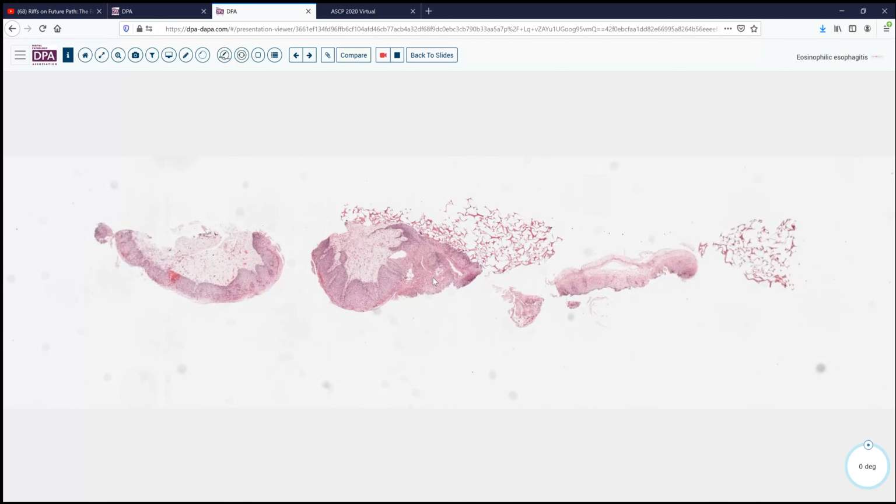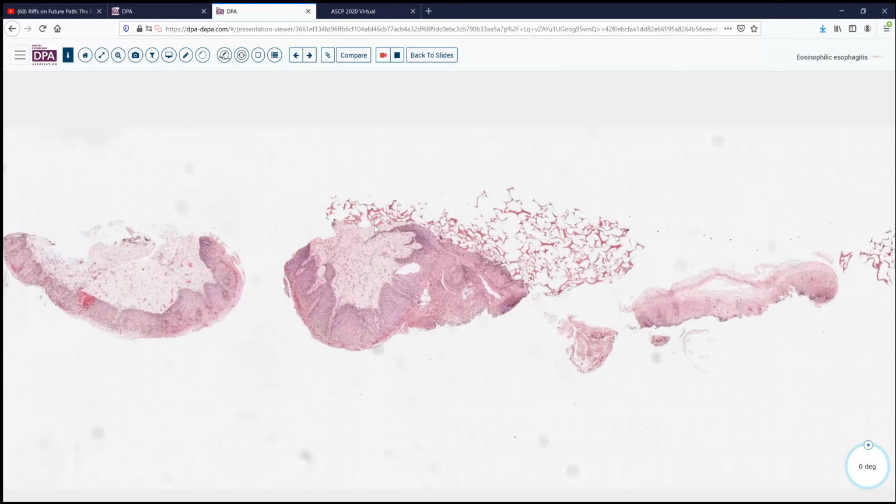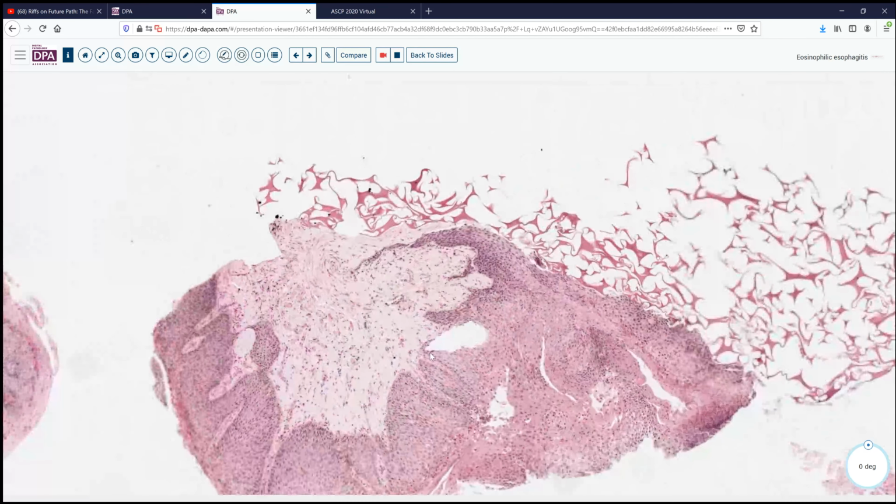Here's another example, this one oriented with gel foam. And as we look here, we notice that this is a little bit less pronounced. We have more lymphocytes along with the eosinophils here. We still have some edema and a lot of these superficial eosinophils and eosinophil granules between the cells, but not quite to the extent we had in that earlier biopsy. So in looking at these, we're thinking that there's some sort of a cause for a dense eosinophilic infiltrate, active esophagitis.